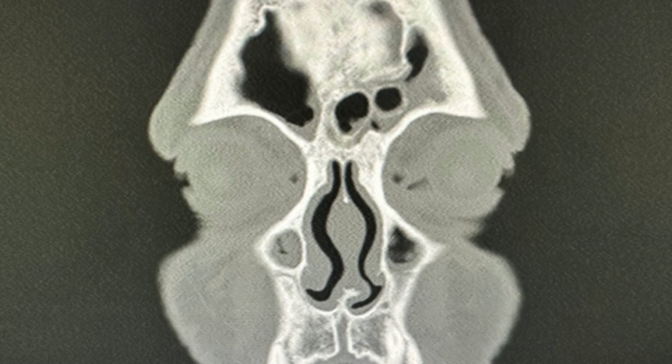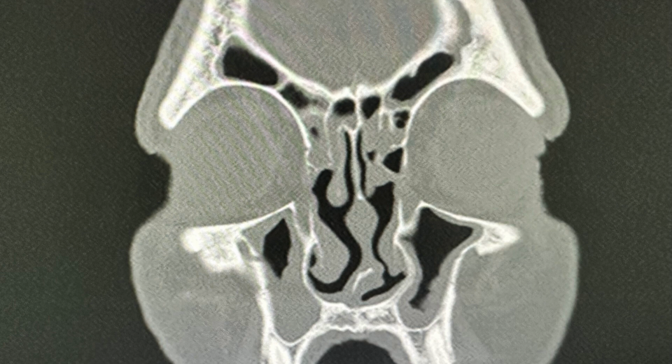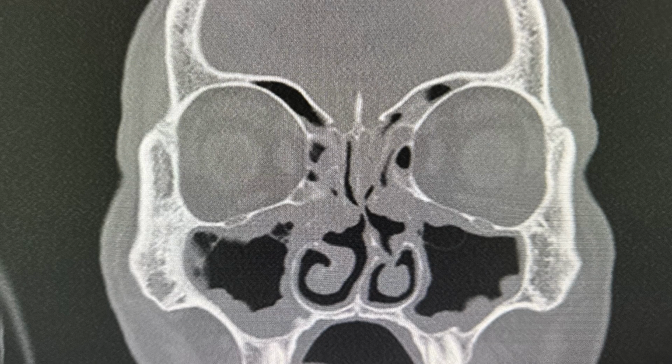This CT scan in the coronal cut shows frontal sinusitis with the presence of two isolated cells in the left-sided frontal sinus. Now, it is very important to differentiate these cells from the anteriorly based agger nasi cells from the posteriorly based frontal bullar cells, which can normally be done only on a parasagittal cut. We shall soon see how these cells are different.